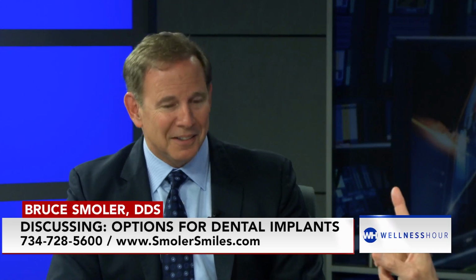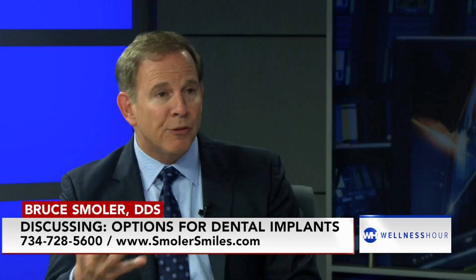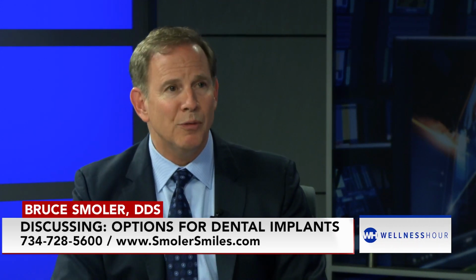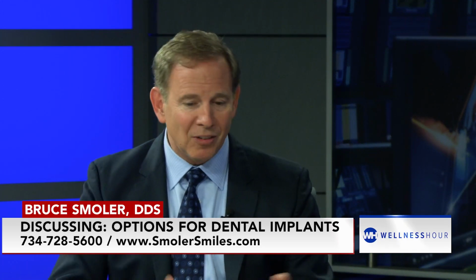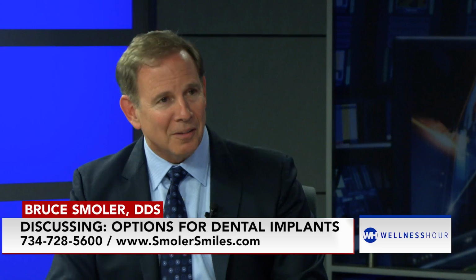Okay. Same as the upper? Snap in, snap out? Yeah, and it's sad because the bone on the upper is not as dense, so you need 4 implants typically instead of 2, but then you're covering the roof of your mouth and you get a snap-in, snap-out denture. And who likes that? Okay. So, no one.